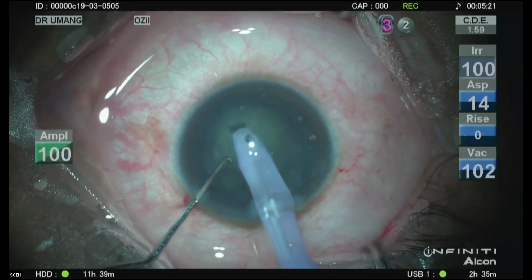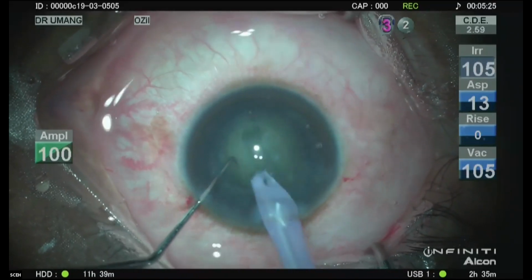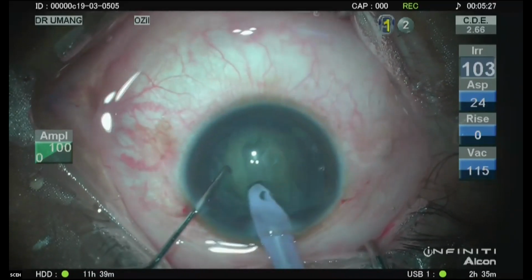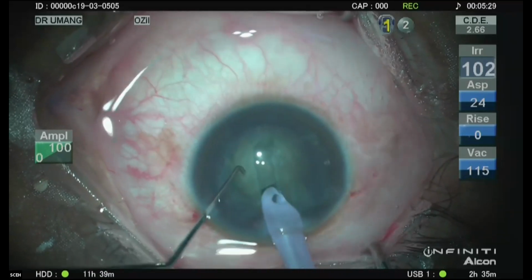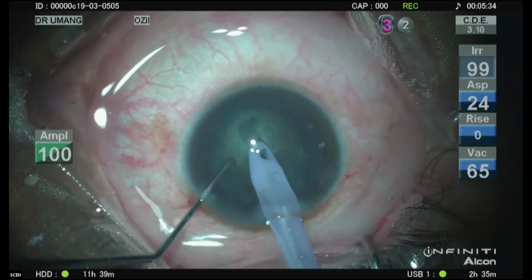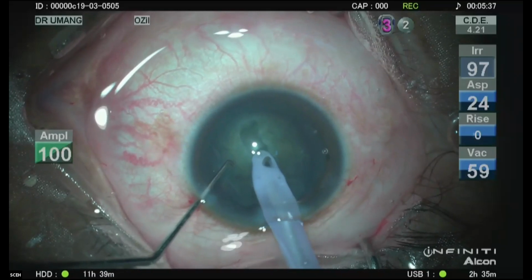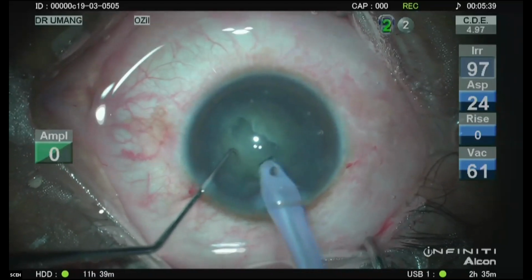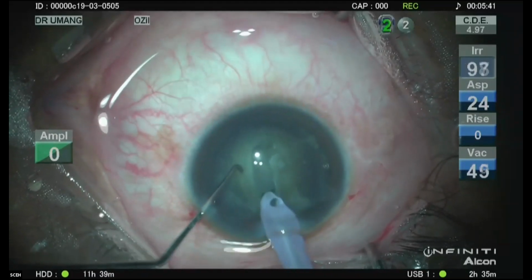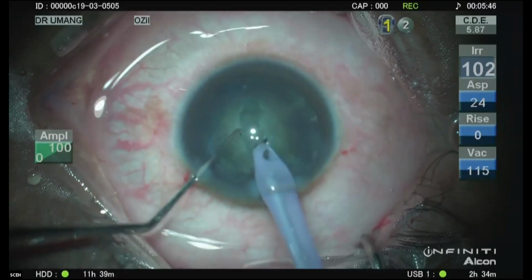and as we discussed, because the hydrodissection was very effective, it seems like a very mobile nucleus. And you can see if there's a lot of movement, trenching becomes a little difficult because it's just moving a lot. Okay.